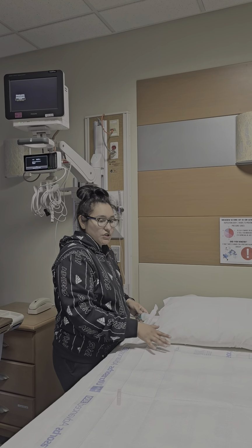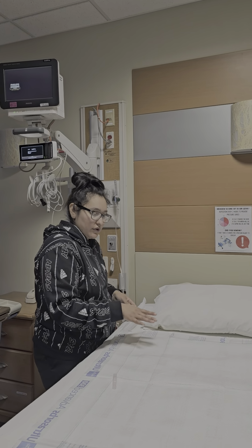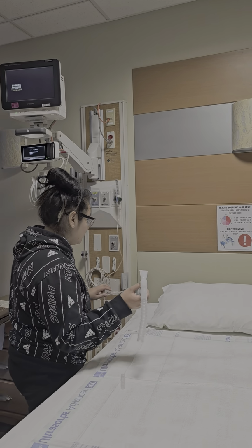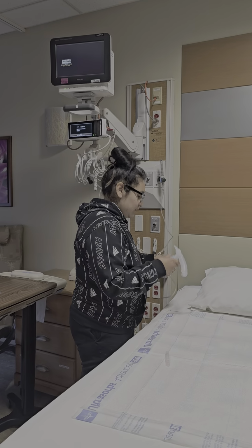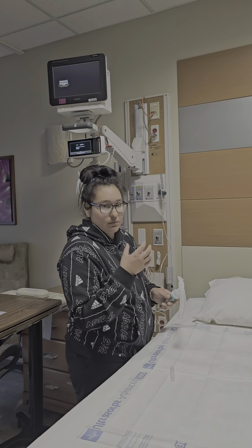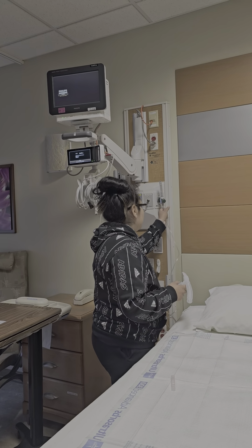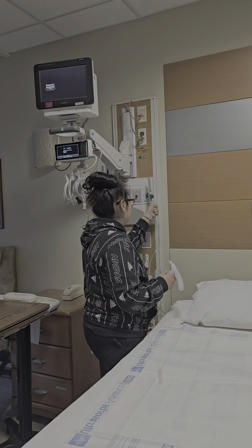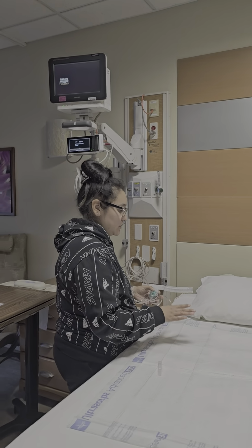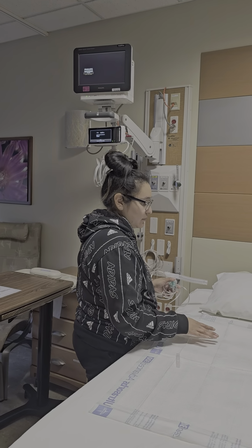You'll want to encourage the patient to cough. If there's any sputum production, then you'll take a note of that. If it was an aerosol steroid, you want to encourage the patient to rinse out their mouth and spit. You'll reassess the patient for effective treatment. Make sure the patient is in a comfortable position.